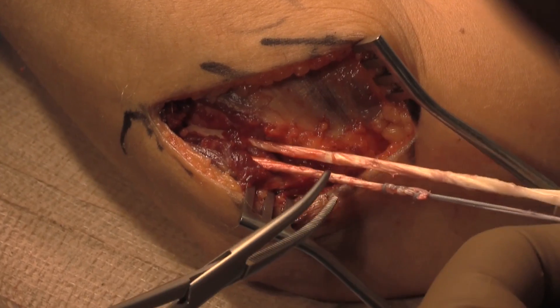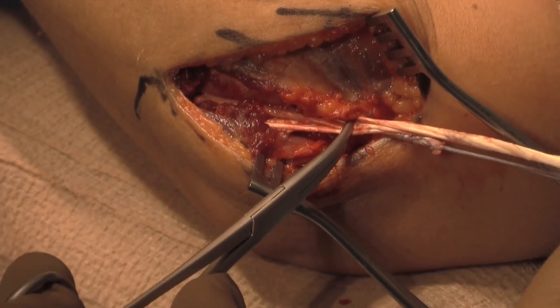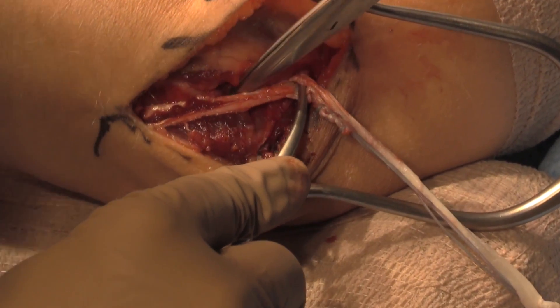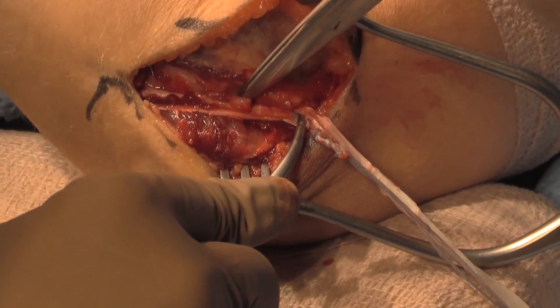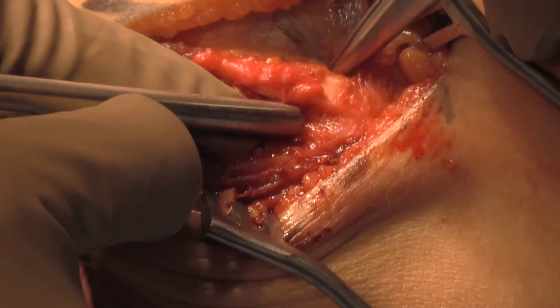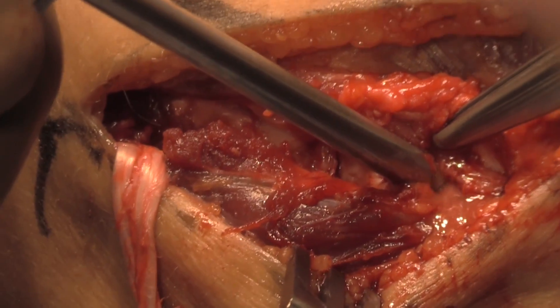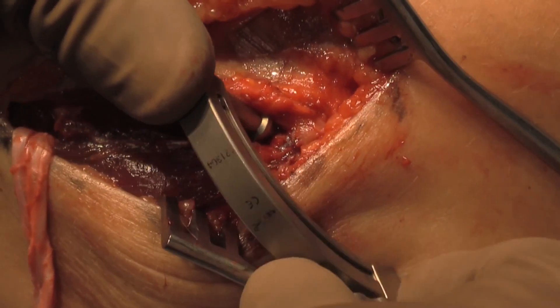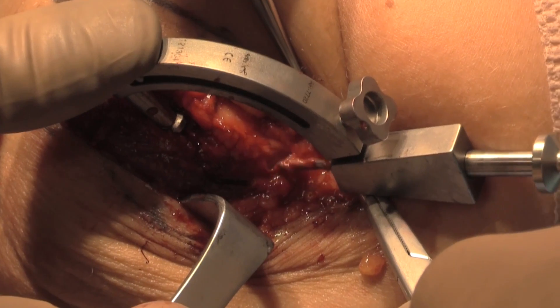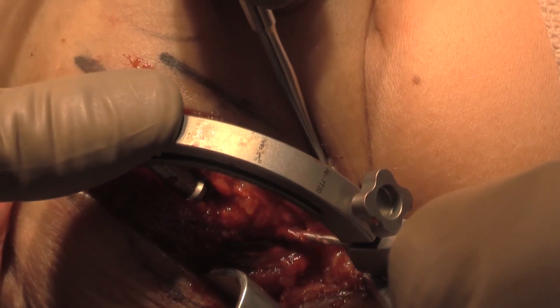After this is complete, we then determine the isometric point on the lateral epicondyle. After this is determined, a 4.5 millimeter guide is used to drill the docking tunnel into the level of the lateral epicondyle. The converging guide is then utilized to drill 2 millimeter tunnels that will allow the docking technique to be completed.